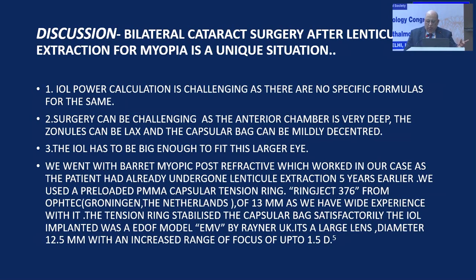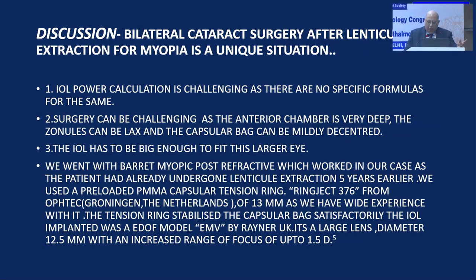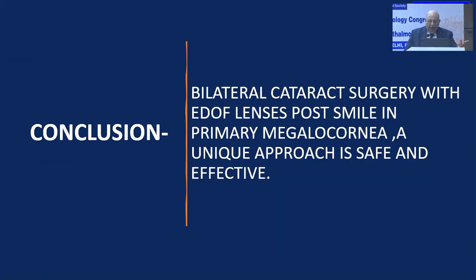Bilaterally, 2 days post-procedure, 1 year follow-up, stabilized. IOL power calculation was challenging as no formula was available. But the IOL has to be big enough to fit this eye. We have utilized a Barrett's formula, which has proved to be fairly accurate. The maximum we could get was the Rayner, which literally worked out well. We put in a capsular tension ring, the Ring Inject from Optech, which is a very soft ring and enables you to get along well enough.